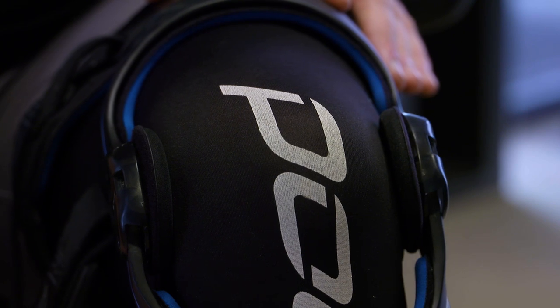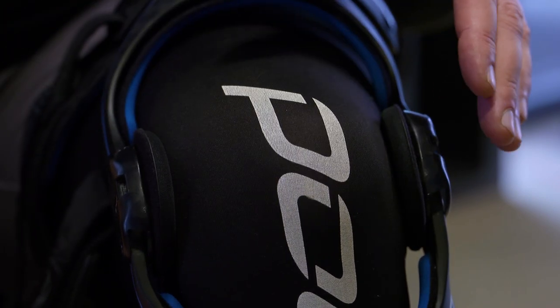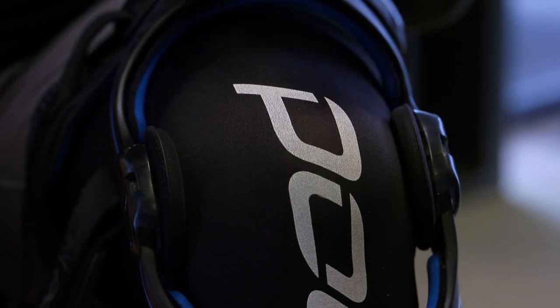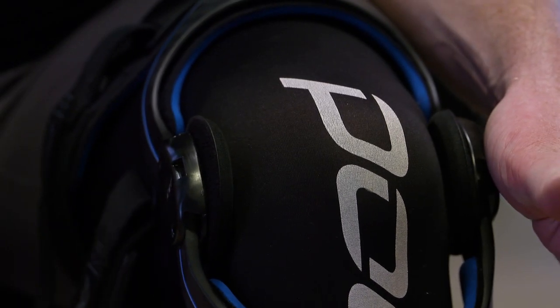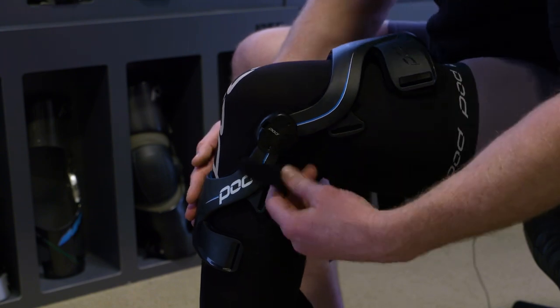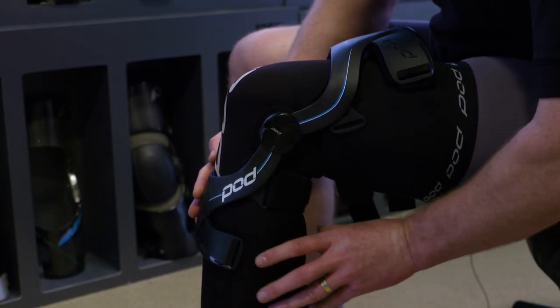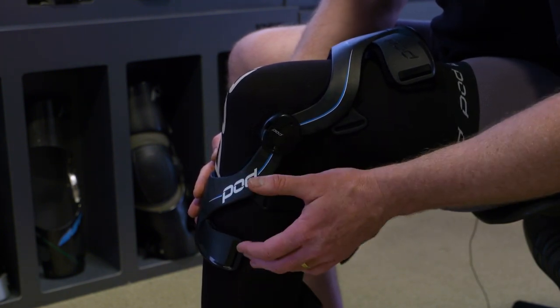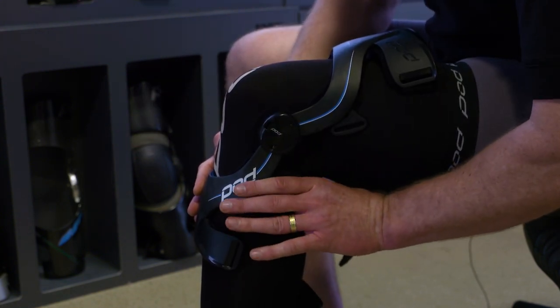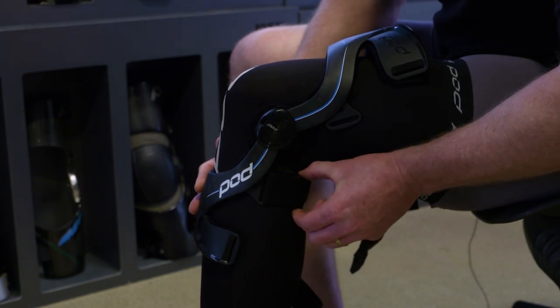With those black large hinge pads in, there's sufficient pressure. There's a little bit of a gap at the front because ultimately your knee is relatively triangular — you want the support right on the side of the hinge housing where the padding comfortably nests against each side of the knee. All of the straps are numbered. Strap number one is the most important — it locks the lower frame in place and sits above your calf, stopping the brace from migrating and slipping down when you're riding. It needs to be done up nice and tight without restricting blood flow, and it has a strap pad in place.